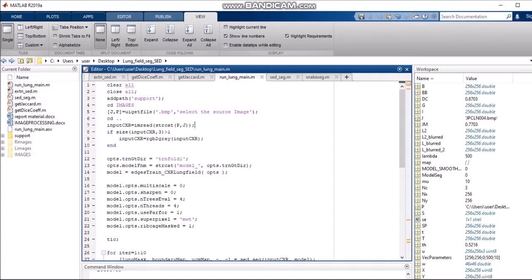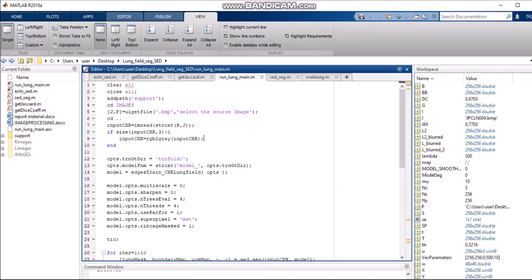We change the directory back to the current one. The variable input_cxr reads our image. If the size of input_cxr at dimension 3 is greater than 1, that means we want a grayscale image. If the size of the image is greater than one or two dimensions, we will convert the image from RGB to grayscale. After all this, we are loading the SED model.